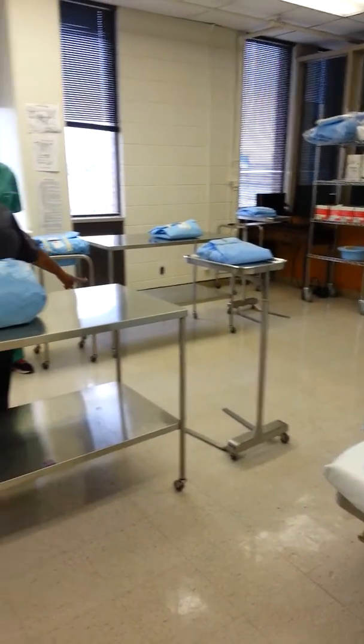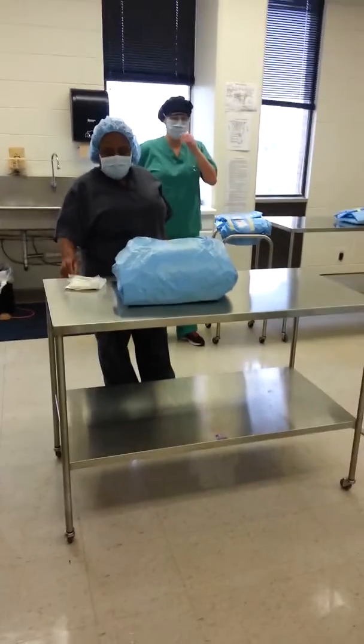So if you look at the orbit, this is the head, and that's the foot. So my ring stand always goes at the head of the patient, and my mayo stand always goes at the feet. My table in the middle.